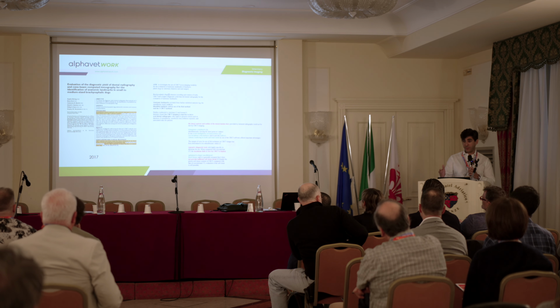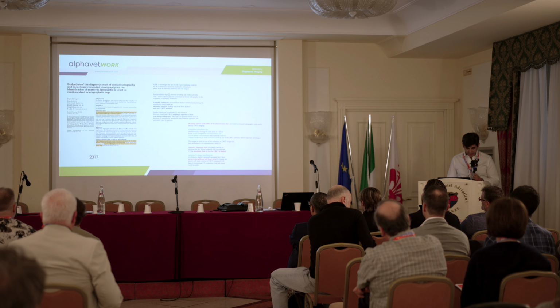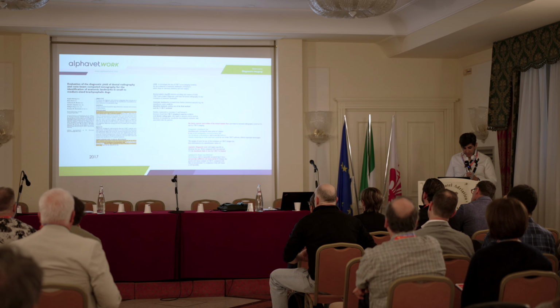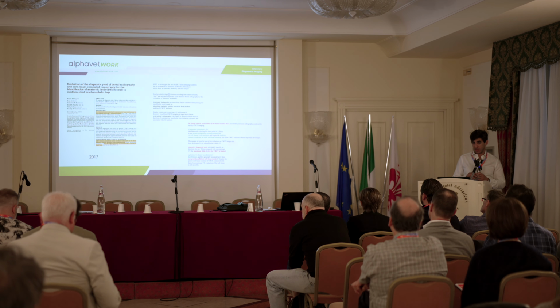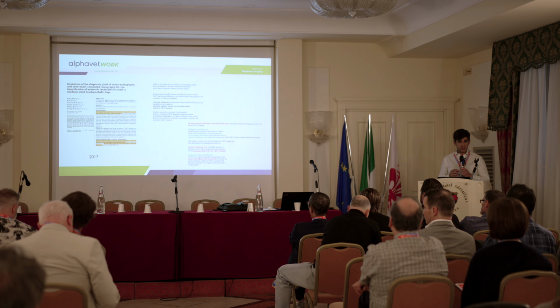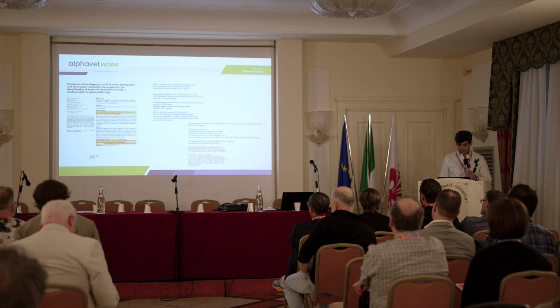And then you have superimposition, distortion, and you cannot decide well. So CBCT was better suited than dental radiography for the identification of anatomic landmarks in brachycephalic dogs. Why? We have bone cysts, eruption cysts, and all this pathology that dentists are more familiar with, and they want the precise landmarks.